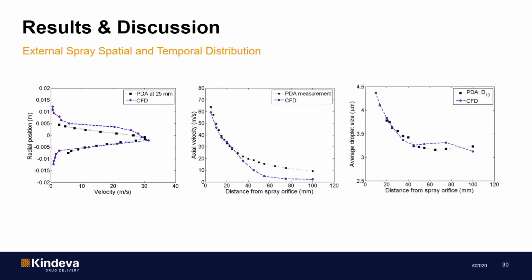And the final figure here is the comparison of the predicted and measured droplet size with respect to axial distance. So the reduction of the droplet size is a result of the spray evaporation, mainly up to 40 millimeter. And after this point, you can see that the droplet size, both in measurements and CFD predictions, remains somewhat unchanged. This is mainly because the HFA completely evaporates and ethanol becomes the only and also the less volatile component of the droplet.